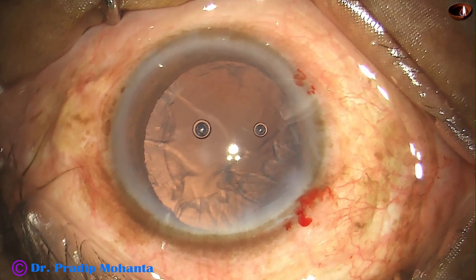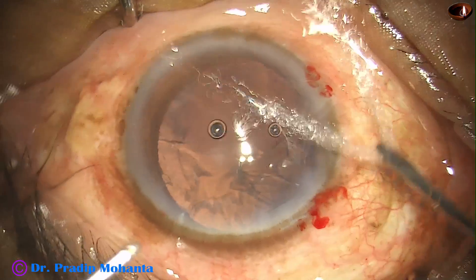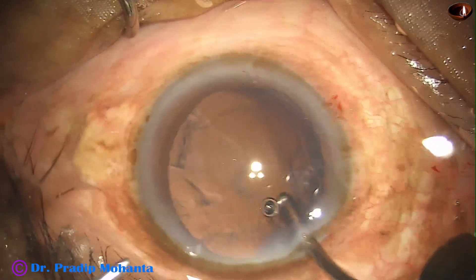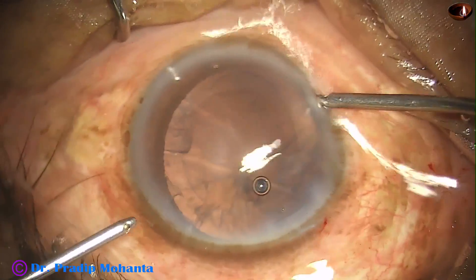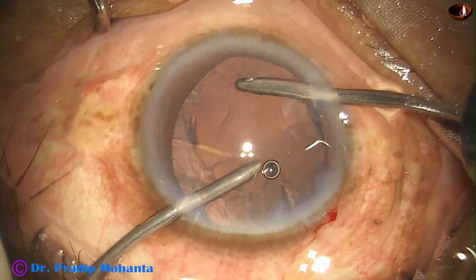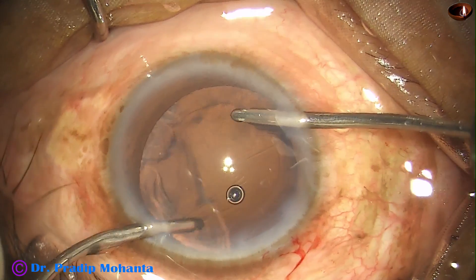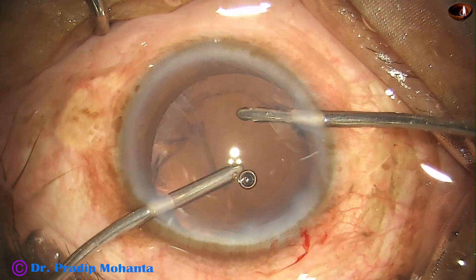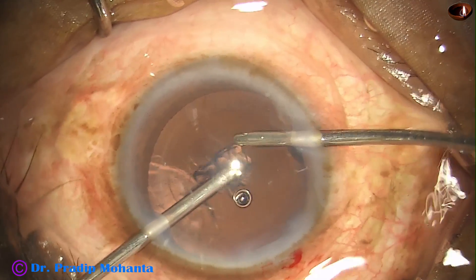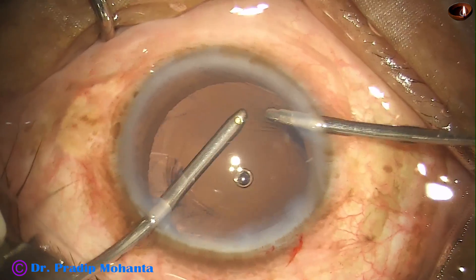And now here is bimanual irrigation aspiration. The irrigation is from the right side port and aspiration from the left, and see how easily you can remove the cortex. It is a joy to work with bimanual irrigation aspiration.